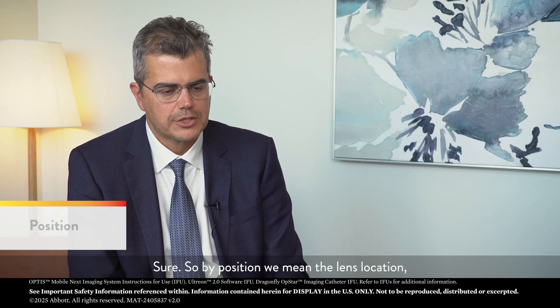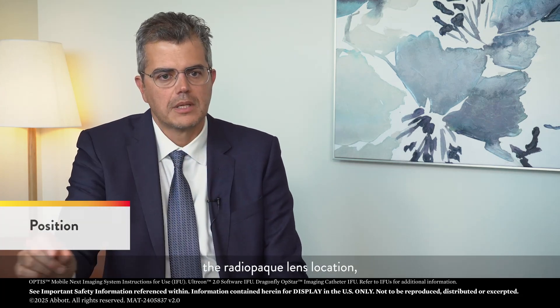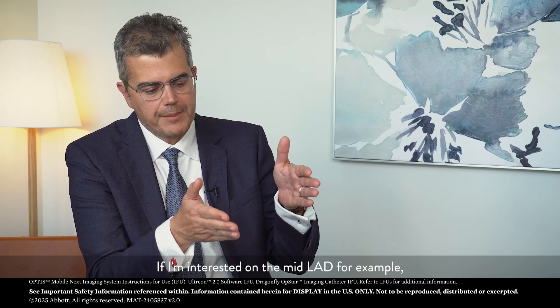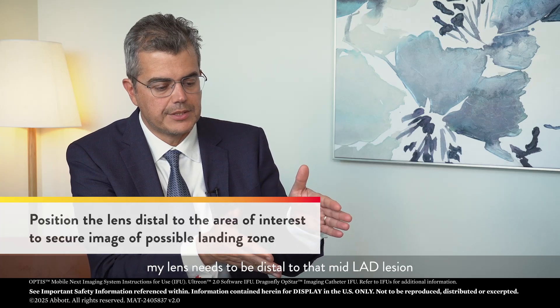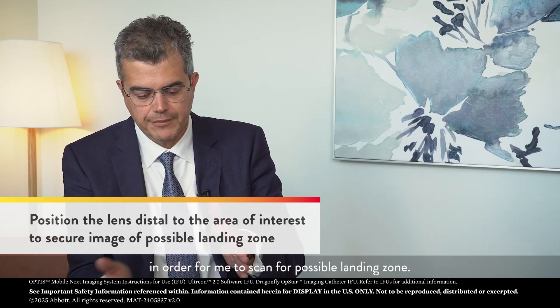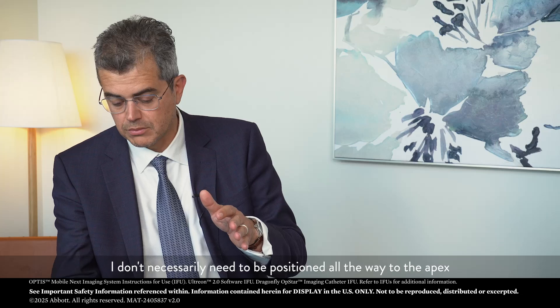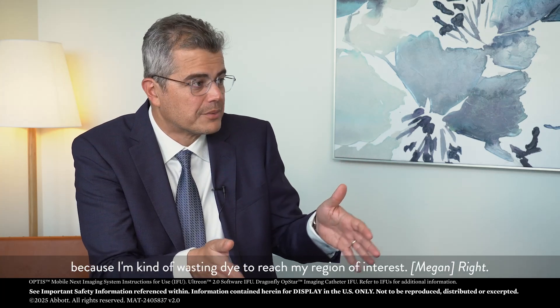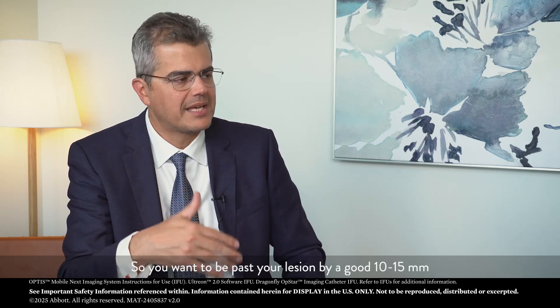By position, we mean the radiopaque lens location in relation to your region of interest. So if I'm interested in the mid-LAD, my lens needs to be distal to that mid-LAD lesion in order for me to scan for a possible landing zone. I don't necessarily need to be positioned all the way to the apex, because that wastes dye. You want to pass your lesion by a good 10–15 mm so you can assess for a good landing zone.